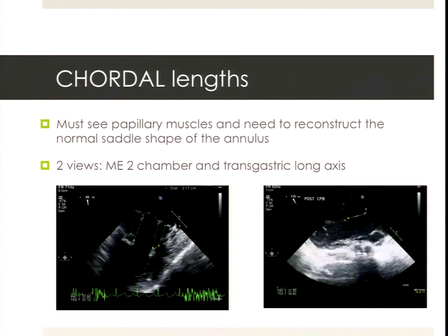So I think it's a useful thing to have in mind when you pass the information over to the surgeon about what sort of sizing they can do, because it'll determine the amount of traction. It also depends on what sort of ring they're going to use.